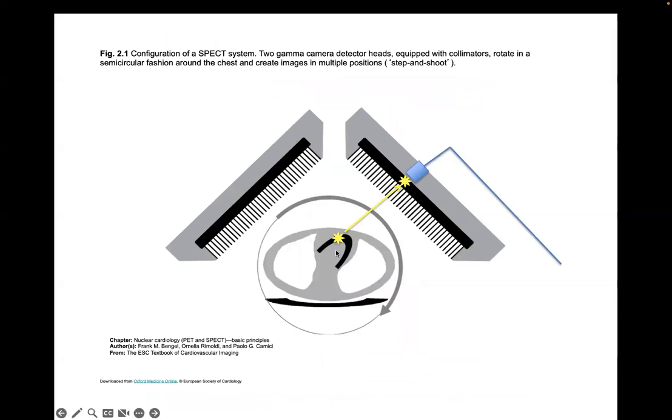As you can imagine, let's say we leave this thing here for a minute, right? We'll get a lot of detected signals on this array, and those will represent a projection of the patient along straight lines that are parallel to these septa that are in the collimator. So we'll leave it here for a minute, get a whole bunch of projections. We build up that signal amplitude projection, and then we'll rotate the entire unit a couple of degrees and get new projections, right? So in this system, we're getting two projections at once. You can imagine if it was even more efficient, you could have a detector down here and a detector over there. You would get all of the photons coming out because they're coming out in all directions, right? So when we have these septa here, we're wasting a ton of photons, right? Because there's a lot of photons going in every direction, but we're only picking up the ones that are parallel here or parallel here at this time.